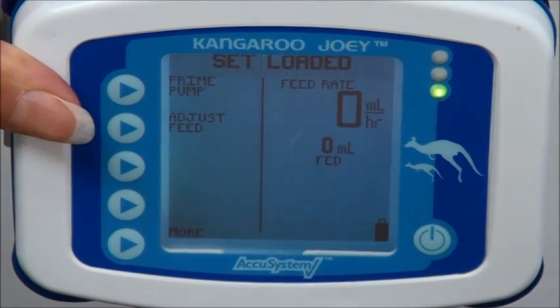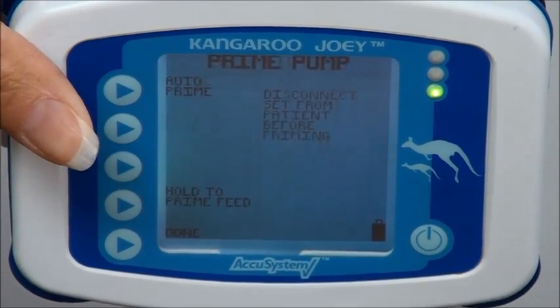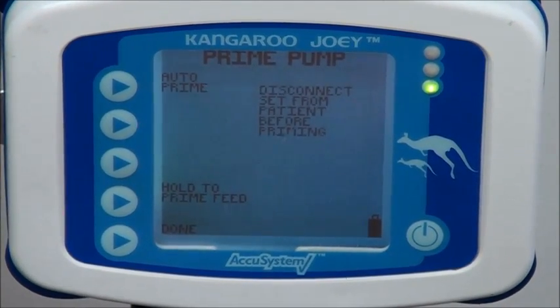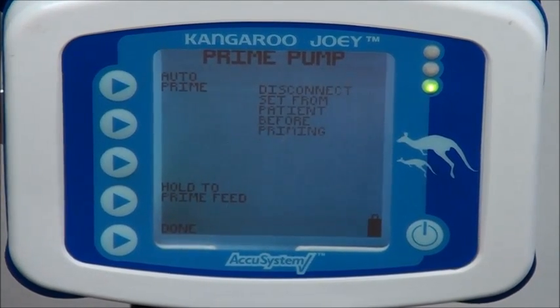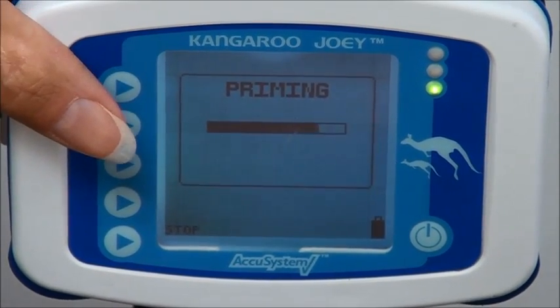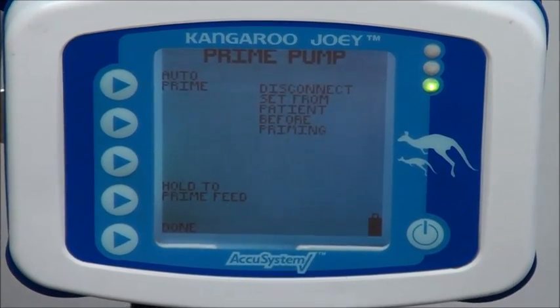The first thing we're going to do is prime the pump. So I'm going to push the button next to where it says prime pump and it's going to tell me auto prime and hold to prime. The first thing I'm going to do is auto prime. I'm just going to push the button next to where it says auto prime. What's going to happen is your food is going to come down through the tube set and it's going to come almost to the end of your pump set. So I'm going to do that. I'm going to push the button and it's just going to automatically prime. When the food gets down to where it needs to be, it's going to stop all on its own.